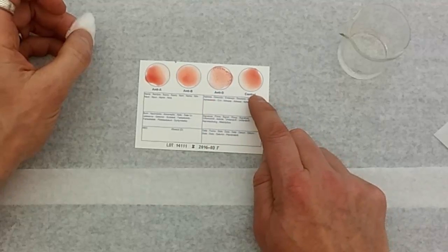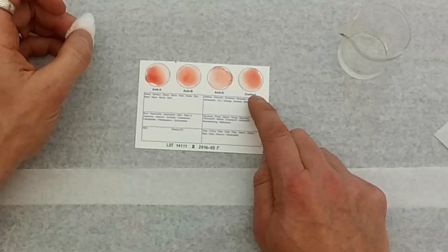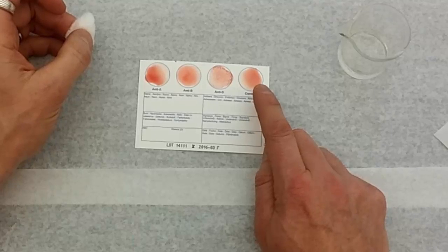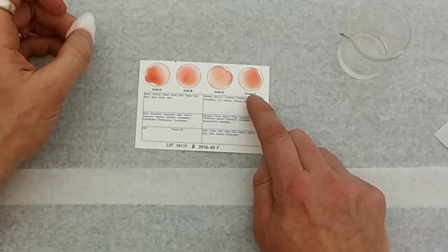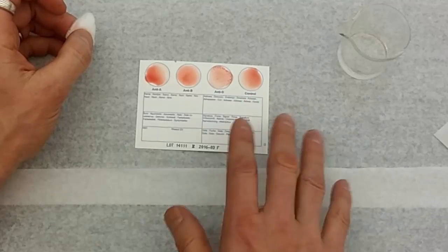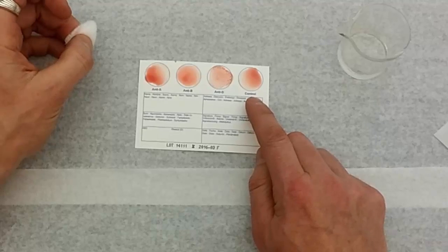And then lastly, in the control circle, remember there were no antibodies on this circle when we started. We should never see a reaction in this circle. If we do see a reaction in this circle, then that means that the test is bad and we have to do it again. We have to throw out that test.